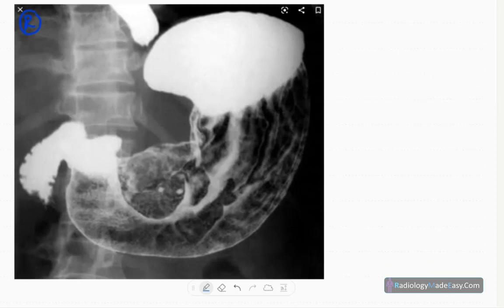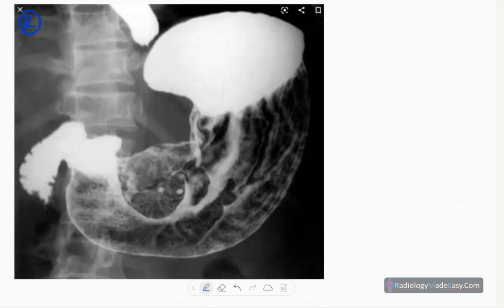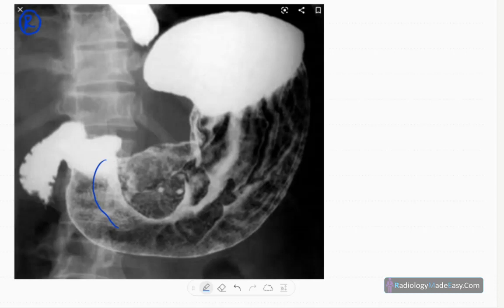When you're looking at this one, the stomach is at the normal position and the distensibility is also normal. But when you look closely here, you can see a filling defect in relation to the lesser curvature of the stomach.